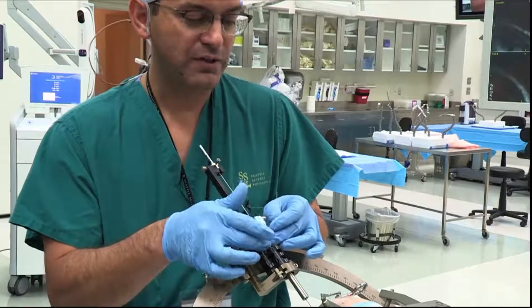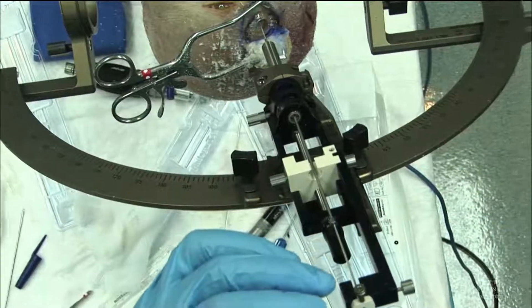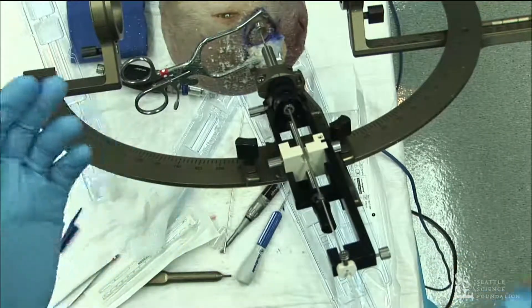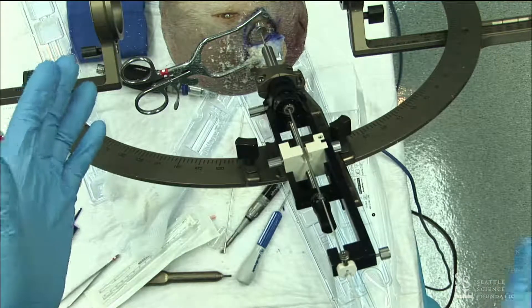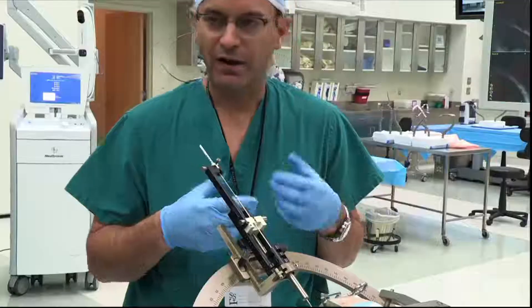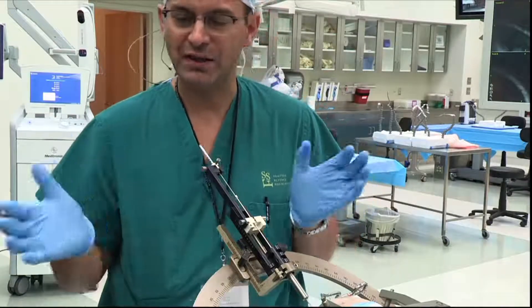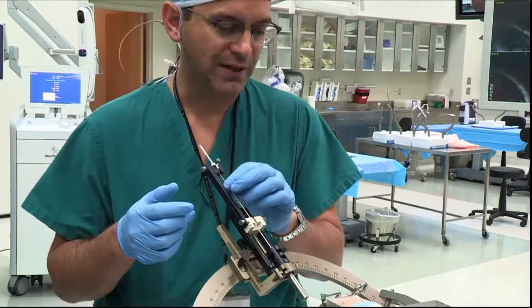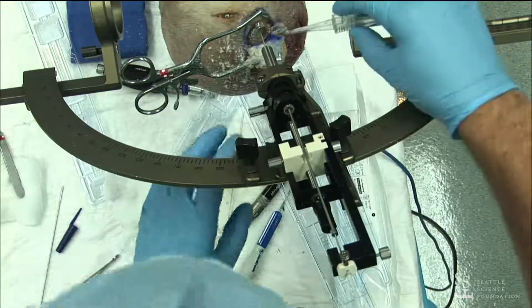We really don't see many issues with wound. I'm raising the cannula now. At this point, we can connect the adapter and run an impedance check. Sometimes in our cases under general anesthesia, we'll also ramp up voltage just to see at what point we start seeing lip contraction, hand grips, or some sort of capsular effect. It's nice to see something just as verification that we're within spitting distance of the internal capsule. So once that's up, we place our little clip and call for CT.